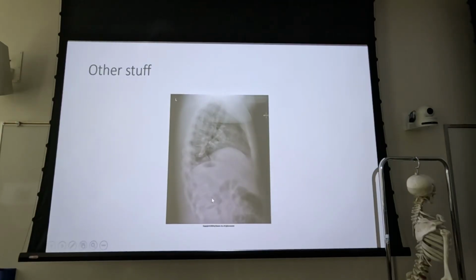If we had good inspiration, it probably would drop the diaphragms down here, and we wouldn't have the appearance that we've got such an insufficient amount of collimation. Our exposure field is probably still a little bit big, but it wouldn't be as bad. Is this the best the patient can do, though? That's always going to be a consideration. And take it a little bit further, is this the best the patient would do? Because sometimes you're going to have those patients who do exactly the opposite of anything that you ask them to do.